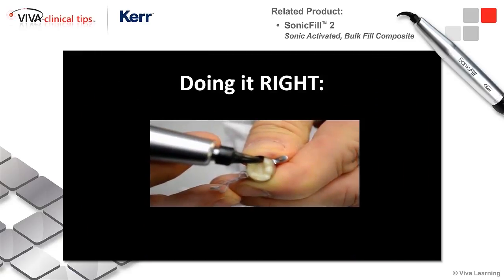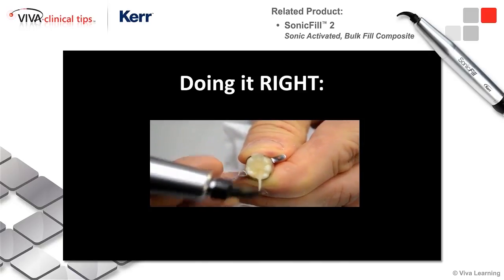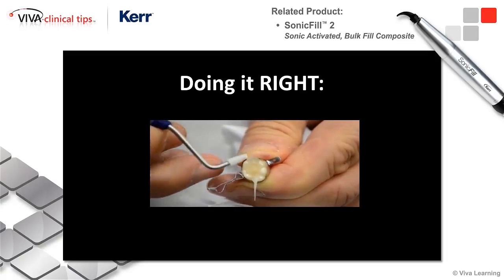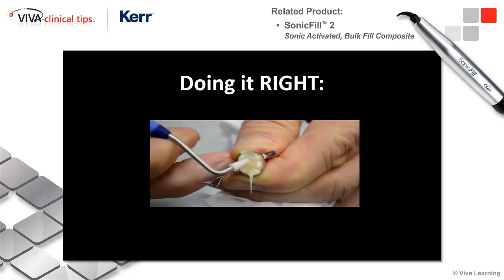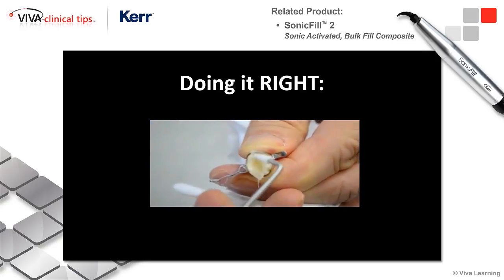So here's a proper technique. You can see you keep it all the way deep down in there and let it fill. Let it go right over the tip. And you can see the consistency as it is. So it's still pretty pliable initially. You just start carving it.